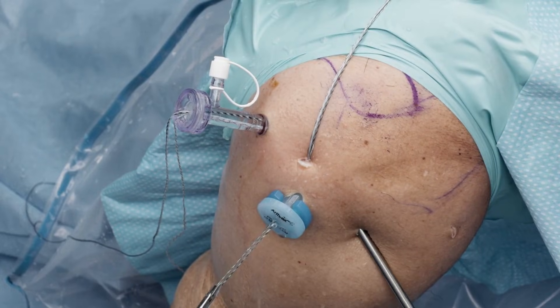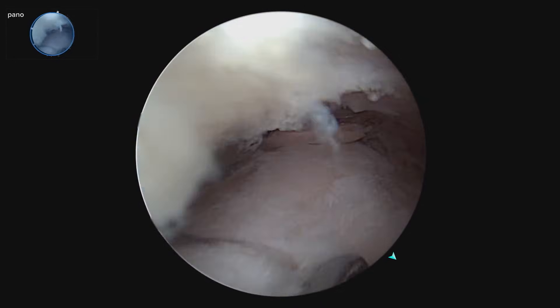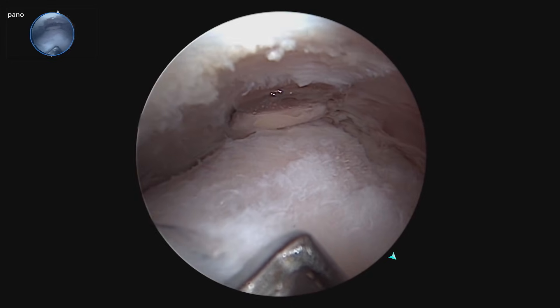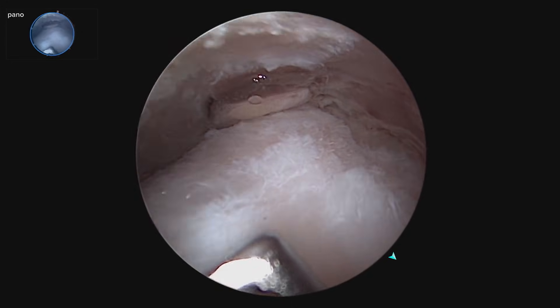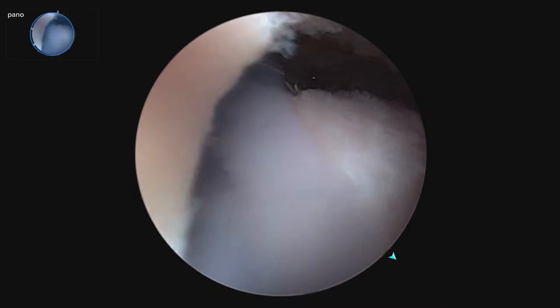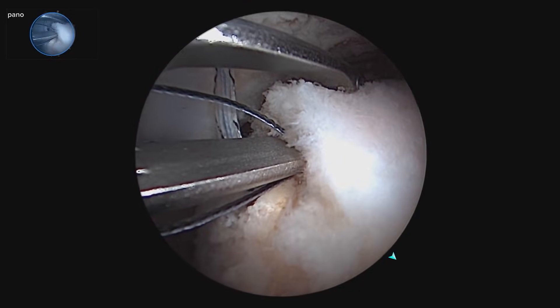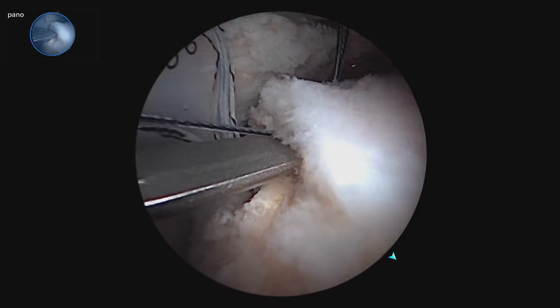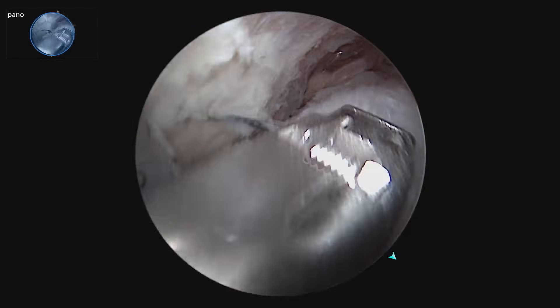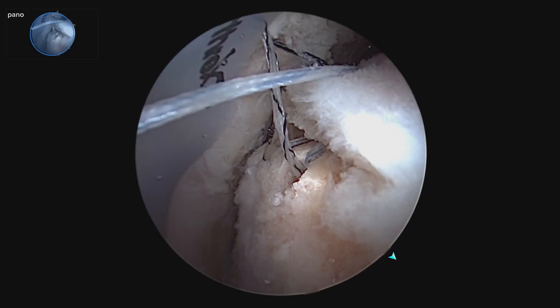We're going to retrieve the black and blue working suture and load the scorpion passer. I'll take a look at our spread — I don't want to hit the other suture from the first anchor, so I'm going to keep an eye on everything. I'll go in, go above it, look and see where my other pass was, then go just adjacent to that. We're going to go ahead and take our second pass, fire it, and retrieve it. So we've got two sutures there and we're ready to convert.